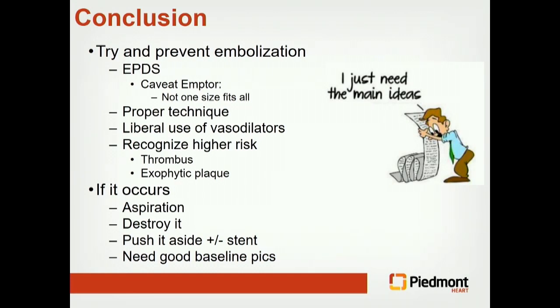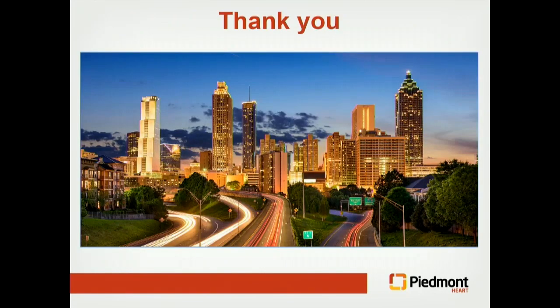And really the key thing here is you need really good baseline pictures to understand whether or not you've actually had distal embolization. Every single time, if it's aortoiliac, if it's SFA, if it's anything, always take the pictures all the way to the foot to start off with and then at the end. And sometimes it's good to try to cross through and take those baseline pictures right off the bat with a third order angiography in the popliteal, so you really get some good pictures to understand what you're up against. But you need to have those good baseline pictures. Thanks so much.